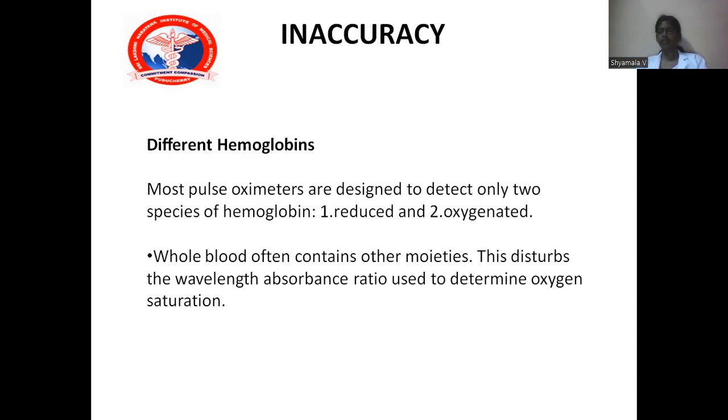Tongue and cheek are reliable sites for patients with hypothermia, but they are affected in patients who have excessive oral secretions or who are in the steep Trendelenburg position. The main disadvantage of placing the probe over the cheek is that it is difficult to place, it is interrupted by airway maneuvers, and there will be a poor acceptance from the patient who is emerging from the anesthesia.